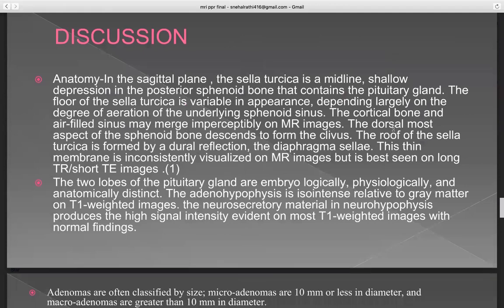In the discussion of anatomy, in the sagittal plane, the sella turcica is a midline shallow depression in the posterior sphenoid bone that contains the pituitary gland. The floor varies in appearance depending largely on the degree of pneumatization of the underlying sphenoid sinus. The cortical bone and aerated sinus may merge imperceptibly on MR images. The dorsal aspect of the sphenoid descends to form the clivus. The roof of the sella turcica is formed by a dural reflection — the diaphragma sellae. The two lobes of the pituitary gland are embryologically, physiologically, and anatomically distinct. The adenohypophysis is iso-intense relative to grey matter on T1-weighted images, while the neurohypophysis produces the characteristic high signal intensity on most T1-weighted images under normal conditions.